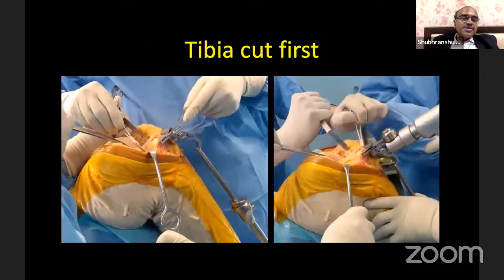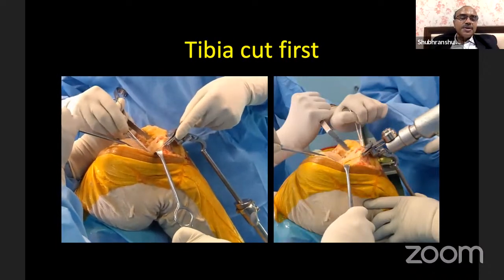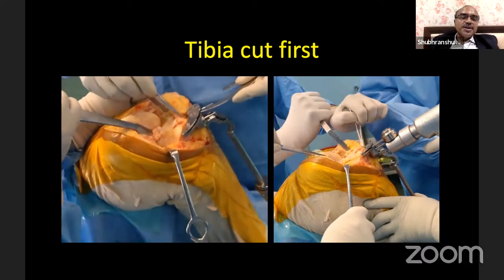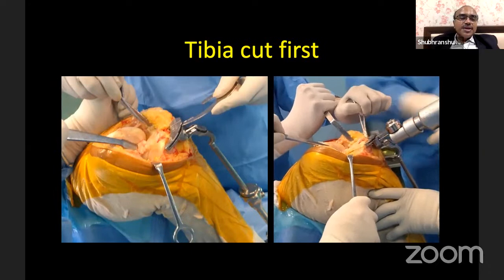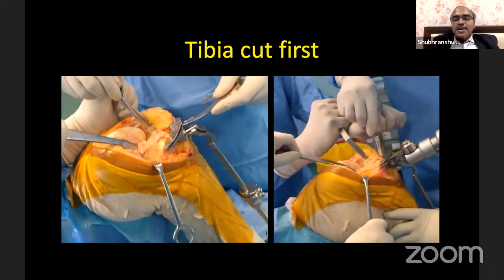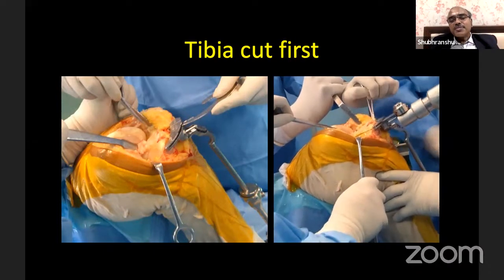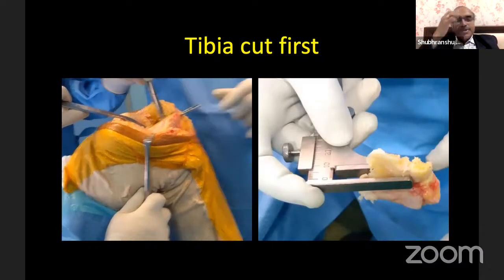Next, I take the tibial cut first. Normally, if there's a defect in the tibia, I tend to take about 8 millimeter or so of tibia from the unaffected side. And whatever defect remains, you can address later on, because you may require a reduction osteotomy where the defect will be taken out, or you may have to build up the defect. So put your tibial jig. Normally, we use an extramedullary jig and then take whatever amount of tibia you want to take. As I told you, in a correctable varus, you have to take a very small amount of tibia, maybe 4 to 6 millimeter. And if there are huge osteophytes and uncorrectable varus, you may also have to take less tibia. So after taking the tibial cut, now this much defect is remaining.